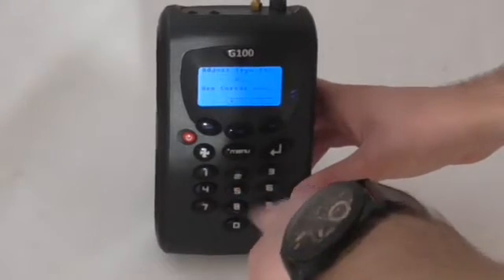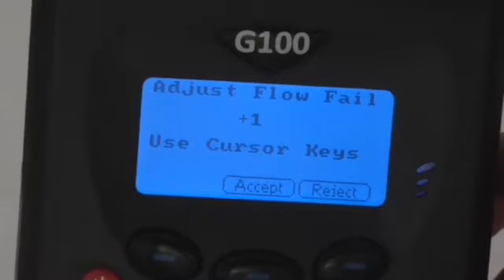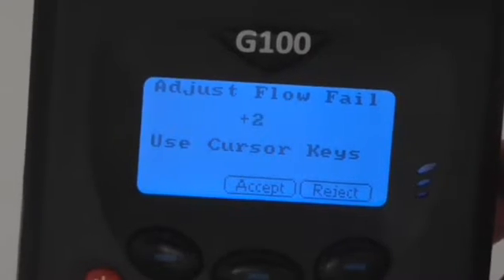Using the 4 and 6 key, you can make the flow fail point less or more sensitive. Press key 6 twice to make the point less sensitive.